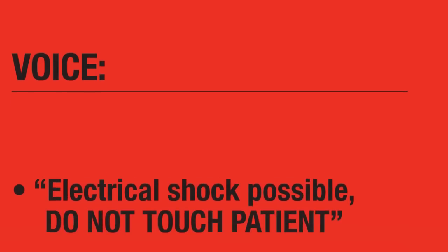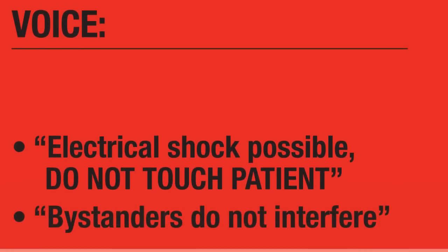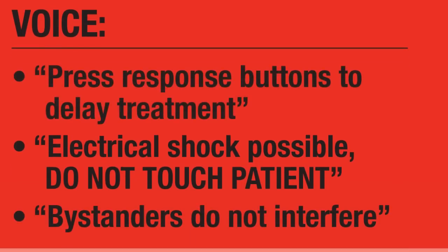Electrical shock possible. Do not touch patient. Bystanders, do not interfere.